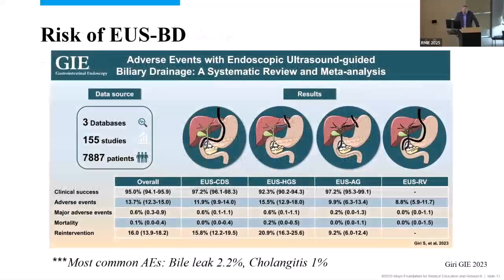And then the final thing I would mention, as this is a debate, is simply things related to EUS biliary drainage. First and foremost, this is not available at every center. This is not available at most centers. It's available at specialized centers with a lot of expertise. In comparison to ERCP, where perhaps an adverse event of pancreatitis is generally mild, adverse events in the setting of EUS-guided approaches are generally a bit more involved. So that's something to consider.